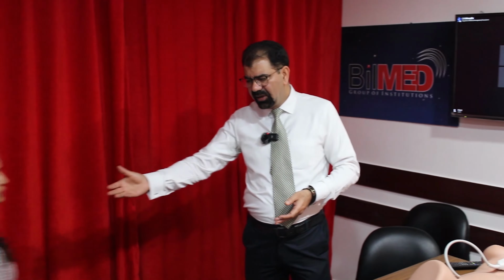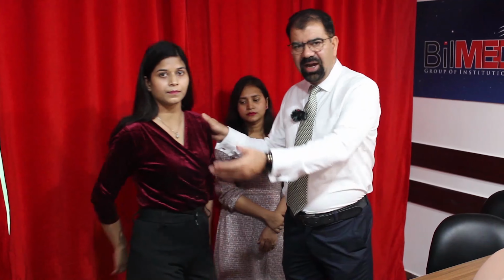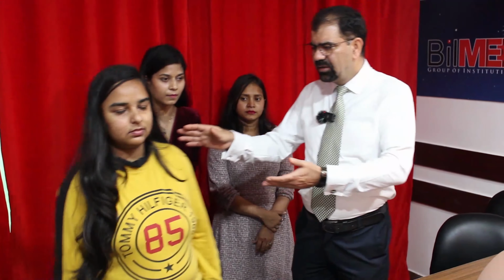Now, for example, if you come to my clinic, I will be scanning a patient. In this patient, for example, I am having a retroverted uterus. In the next patient, I am having an ovarian cyst. And in the next patient, I am having maybe a normal. Now you want to see maybe an ectopic pregnancy. Where will I get a patient with an ectopic pregnancy from? If you sit for maybe 6 months or even 1 year, I may get one ectopic pregnancy or may not get even one.